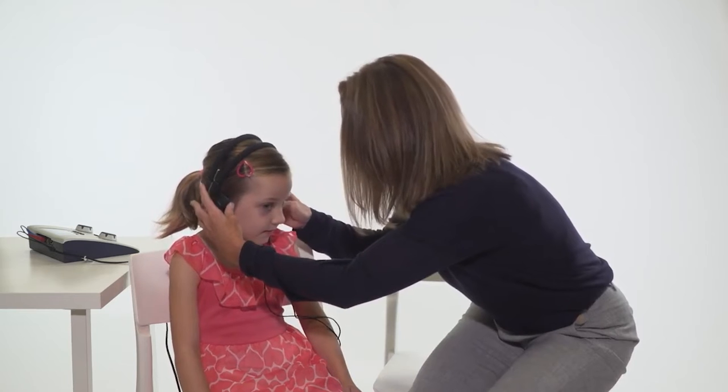Adjust the headband so the headphones are centered over the ear canal. Placement of the audiometer is important — you don't want the child to see your hand movement or presentations of the tone. Have the child turn slightly away from the audiometer.